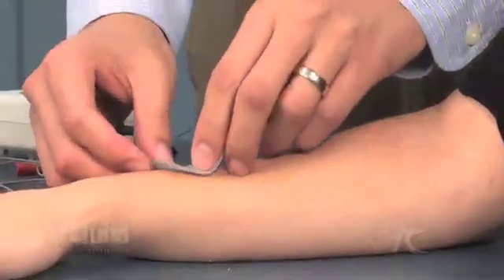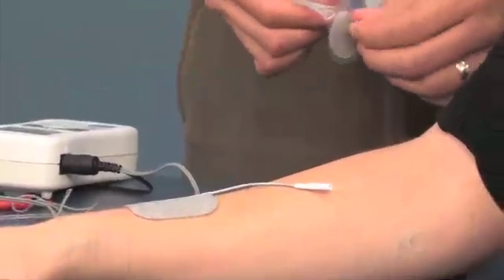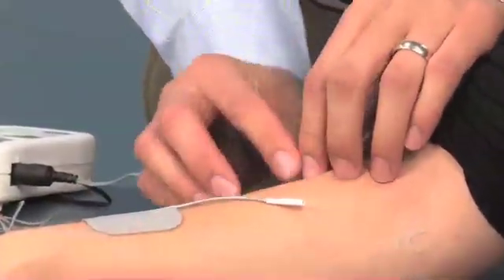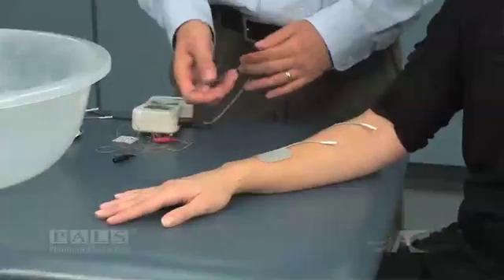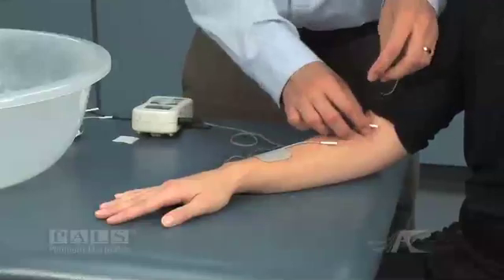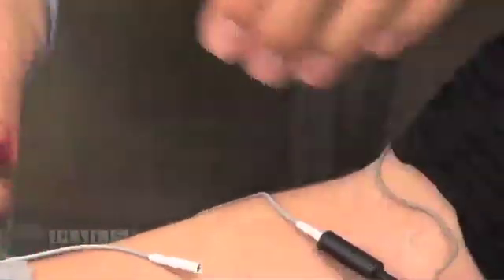Place the electrodes in the predetermined location, making sure that your lead wires move away from the joint angles, and that the electrodes are smooth on the skin with no wrinkles. Then place your lead wires into your electrodes, being certain of your polarity.